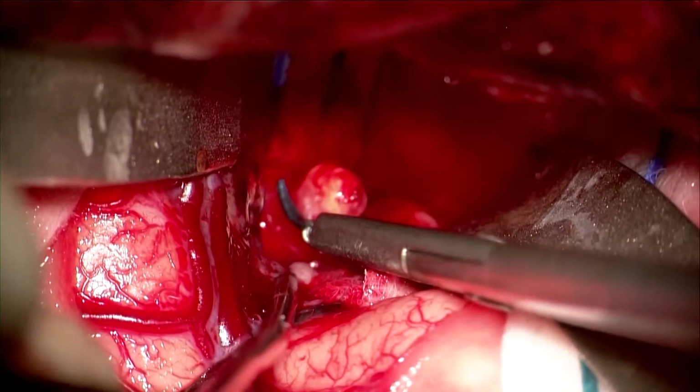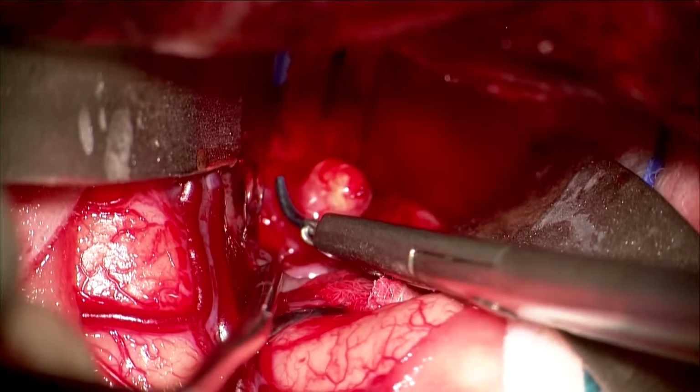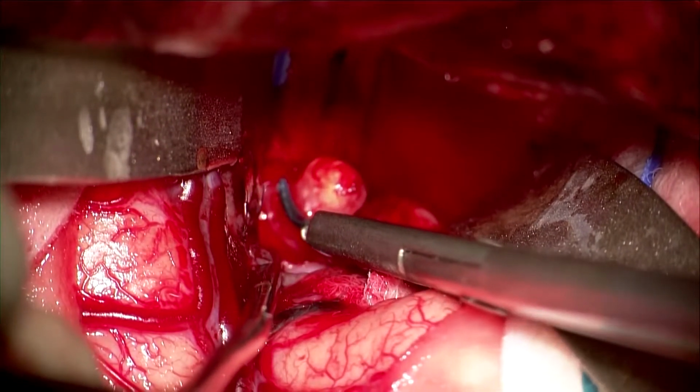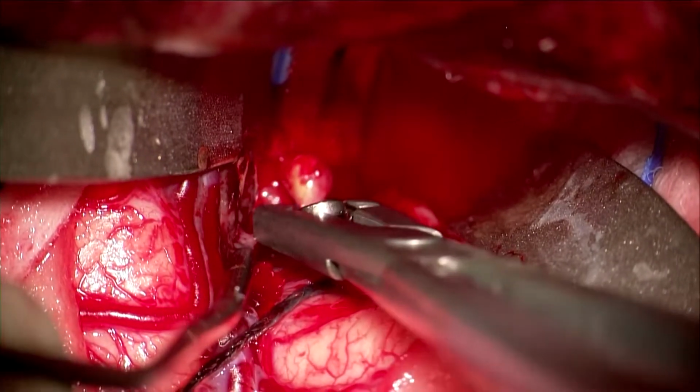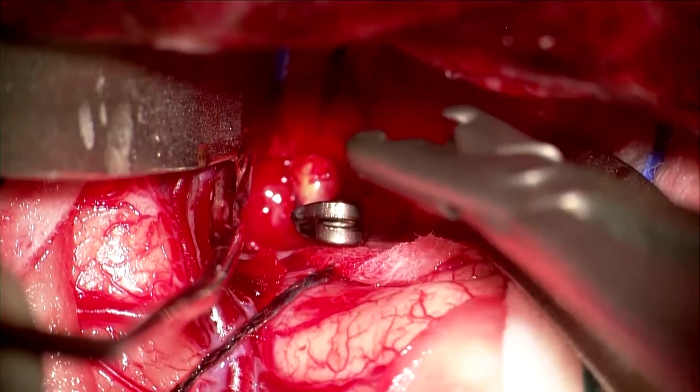Here I am gradually placing the clip around the base of the neck of the aneurysm, and once I feel confident that the aneurysm and its entire neck is within the clip, I will close the clip blades.